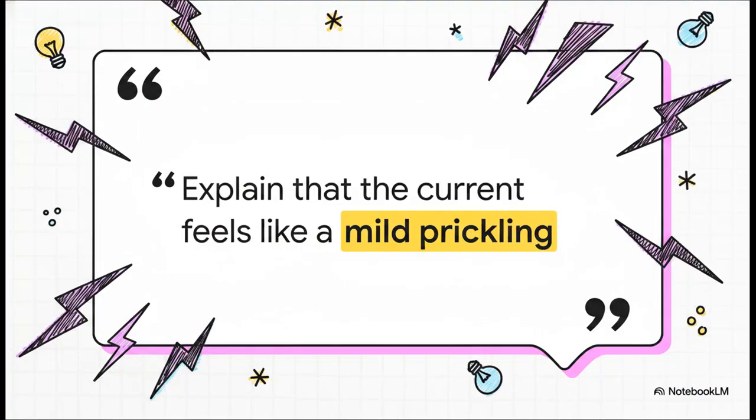All right, let's jump into preparing the patient. Before you hook anything up, your communication needs to be crystal clear. You have to tell the patient exactly what it's going to feel like. Use the phrase mild prickling. Setting that expectation right up front completely manages their startle reflex and takes away the anxiety of being suddenly zapped by a machine.